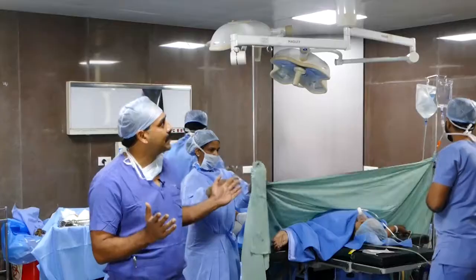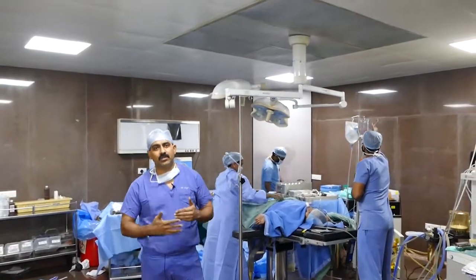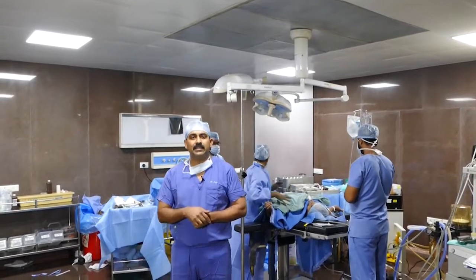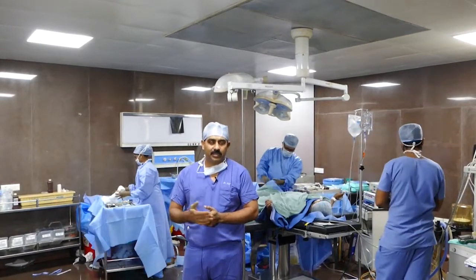Once we start off with the surgery, the limb is prepared under sterile precautions, and it's taken up in a sterile theatre with a different sort of airflow called laminar airflow, where you want the air to be purified in a very different manner. So it's actually a different theatre. It's not the regular theatre where we take the patient for a knee replacement or any other joint replacement.